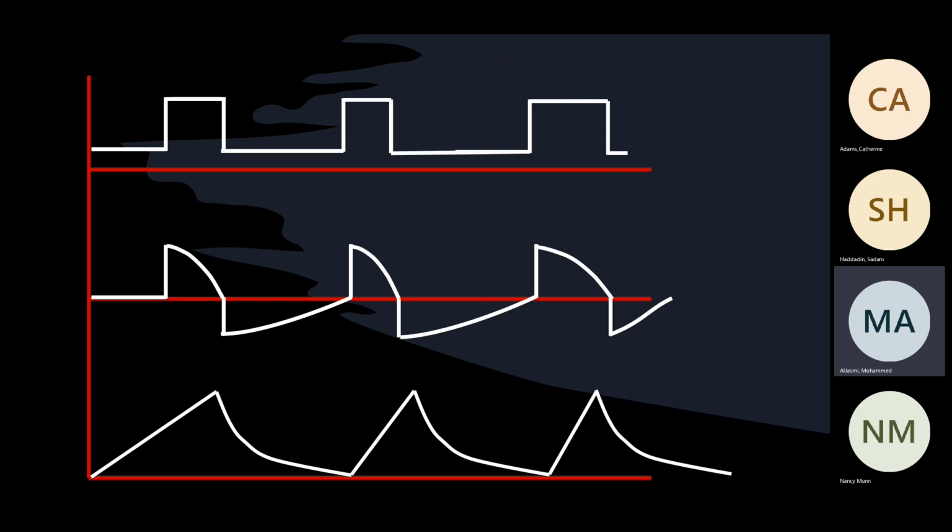So we agree that in these waves the volume is the same, right? Yes. So in pressure control, you can still have the same volume. You need to watch three more breaths or four. You need to watch more, and you don't need to just pick on the volume and decide. So what you should pick on is the flow. The shape of the flow is better than the shape of the volume. If the volume is obviously up and down, you might know.